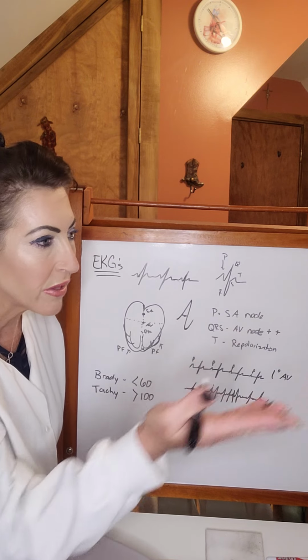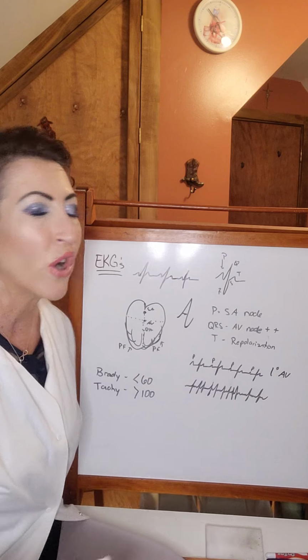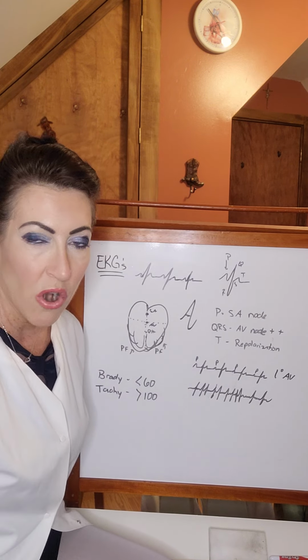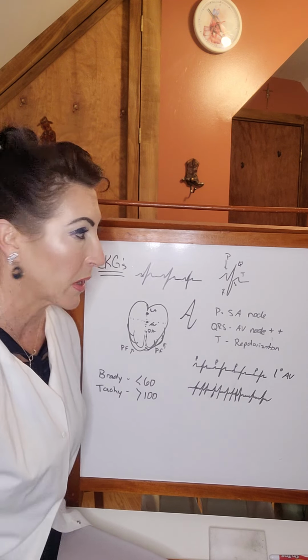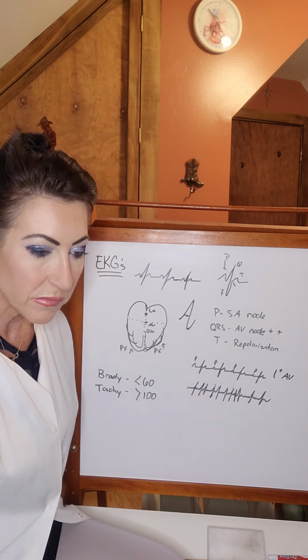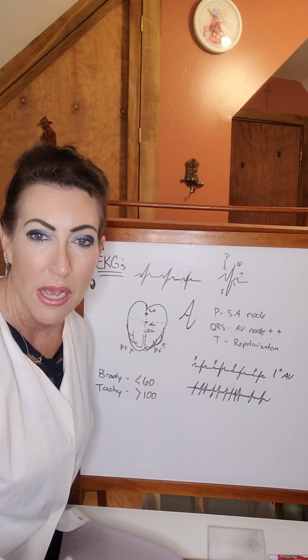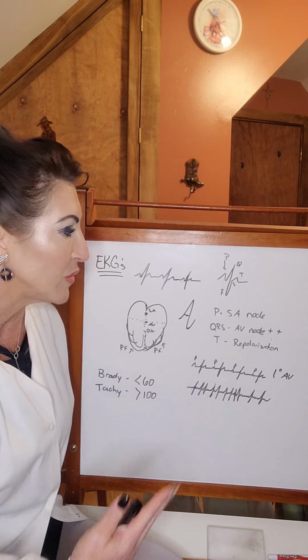I could look on the monitor and tell this patient all the time. I can't tell you how many times I've hooked a patient, or all of us have hooked a patient up to a monitor, and we're like, what kind of heart history do you have? Who's your cardiologist? And they're like, what? No, I don't have any problem. I'm like, you do. And I'll run and get an anesthesiologist, and we'll either cancel the case or try to figure out what's going on, see if he's symptomatic, see if we can get a previous EKG from his primary or something to compare to.